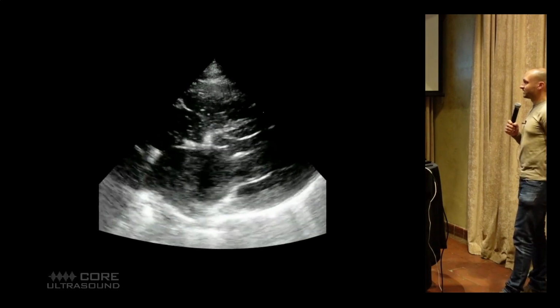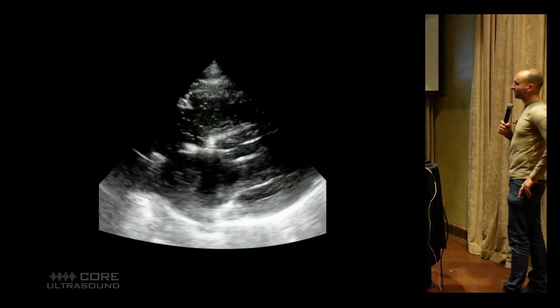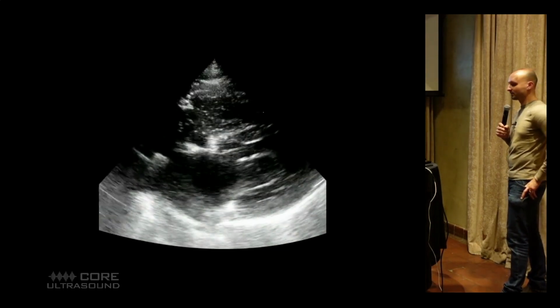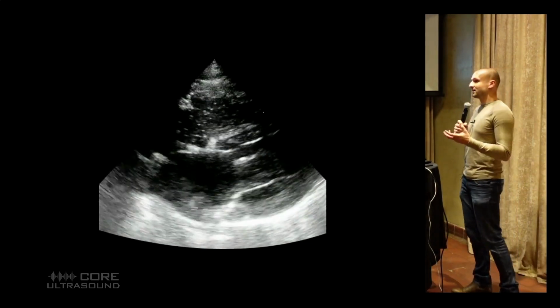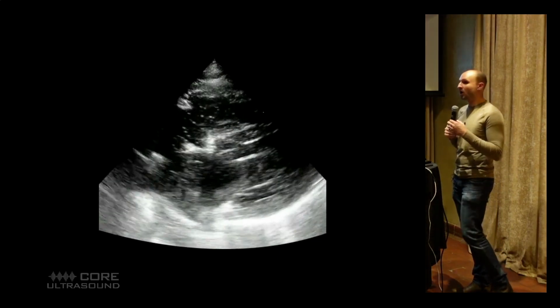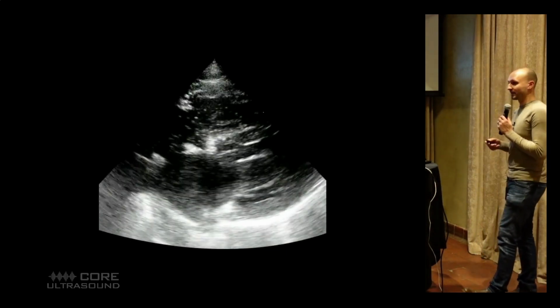This is something here that if you're not careful with, you can get confused. Would you consider this cardiac activity? I mean, but look at that right side of the heart. It's moving. It looks like the right side is contracting a little bit. Or it's the effect of the BVM. If you have somebody pushing pretty strong pressures through that BVM, it will make the heart move like this. So just be careful.